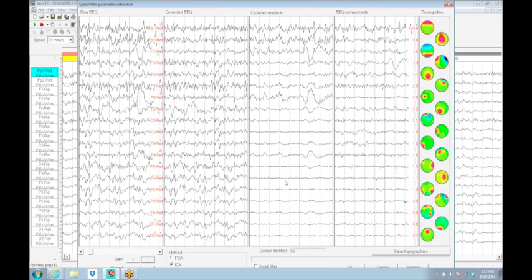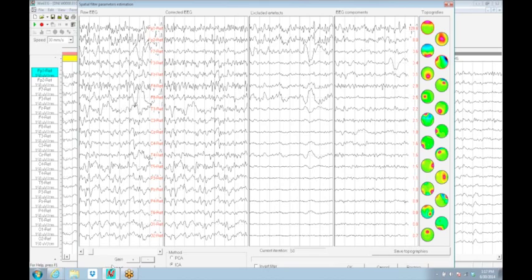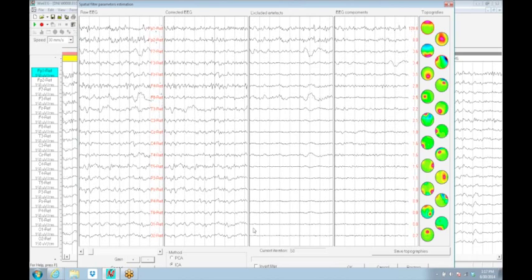The term gain is actually an amplifier characteristic. These are display characteristics, which should be labeled sensitivity, not gain. That's a very common misnomer. Other than for techno geeks that are purists, they're not going to get their nose out of joint about that. But that is a misnomer. It should be sensitivity, not gain. It's changing your display, not the amplifier.